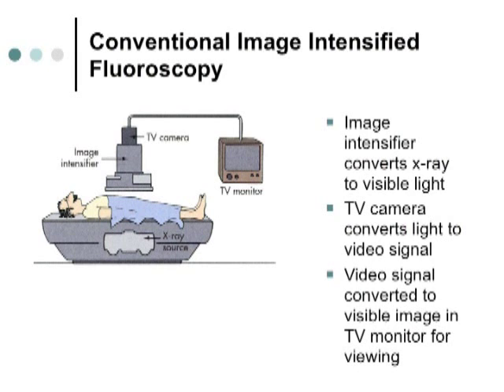Most of you, however, work with mobile units, right? C-arms. With a C-arm, the disadvantage is there's no table to protect you from the scattered radiation and from what we call the leakage radiation that's coming out of the X-ray tube. So stationary units do have an advantage in that the X-ray tube below the patient is protected in the table base. So this produces the X-ray just like a normal X-ray machine. The only difference is during fluoroscopy, the X-ray is continuously produced.